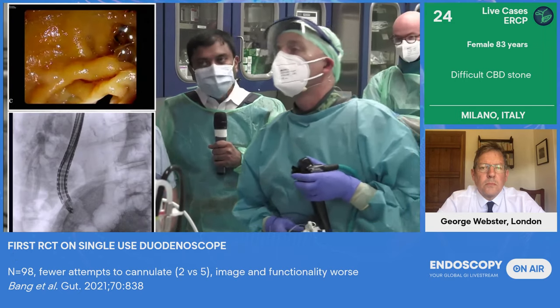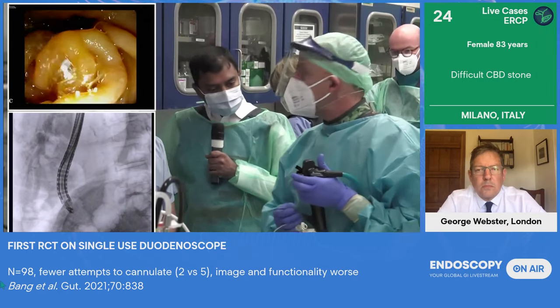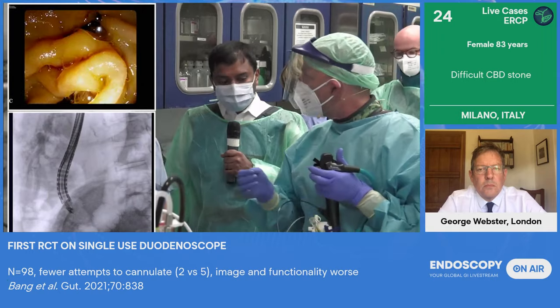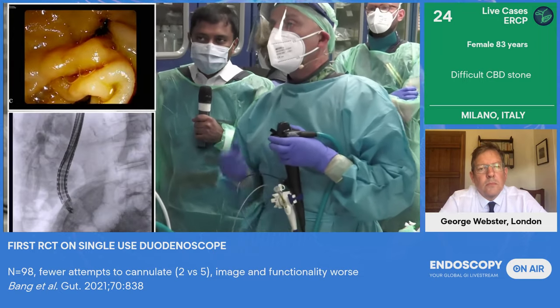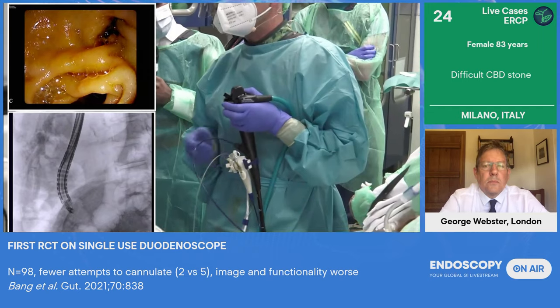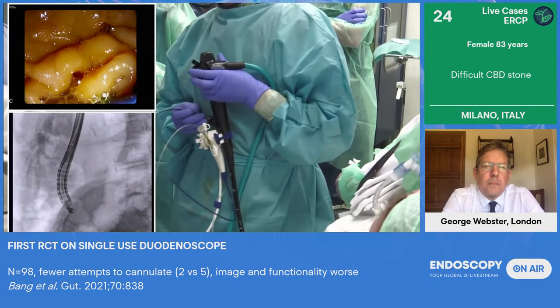So Andrea, do you want to move forward? Yes, please. Actually, to add something, we realized that also the pushability of the accessory inside the channel is very good, probably due to the shape of the scope and the stiffness of the scope. We have already removed the plastic stent, and we are ready now to enter with the SpyGlass. And we are doing it freehand.